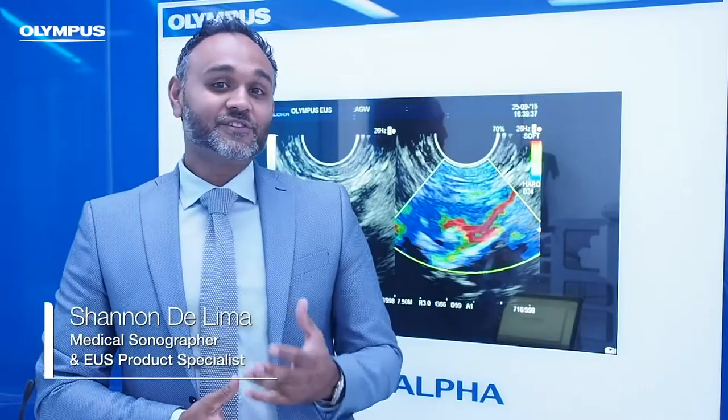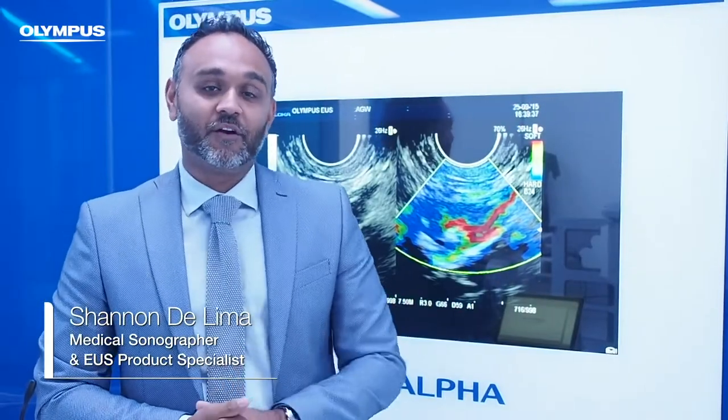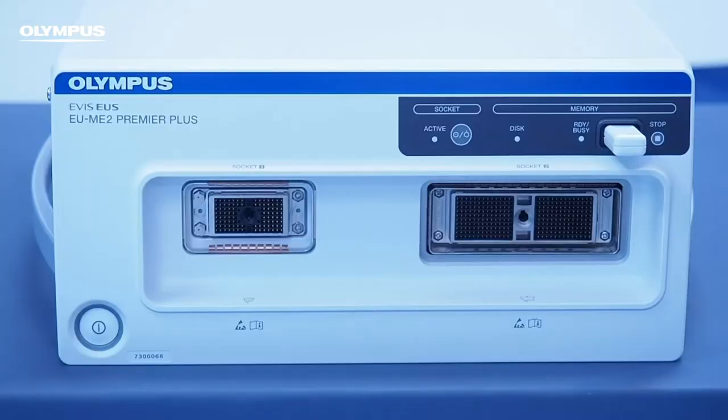Hi there, welcome to this short video on elastography on our EU-ME2 ultrasound system. Elastography is an evolving diagnostic trend that helps you evaluate the relative stiffness of your target lesion.